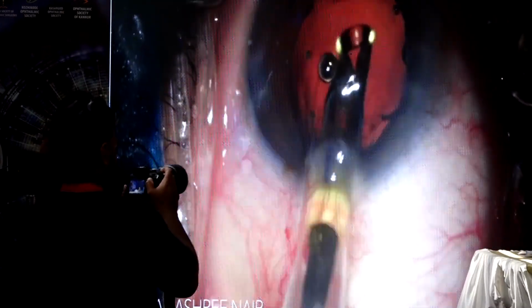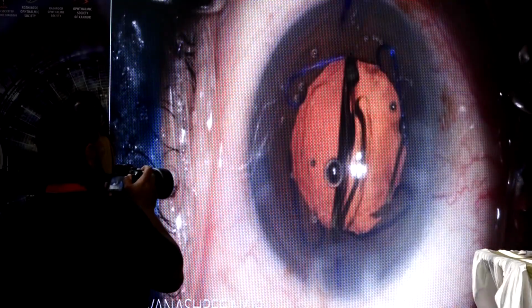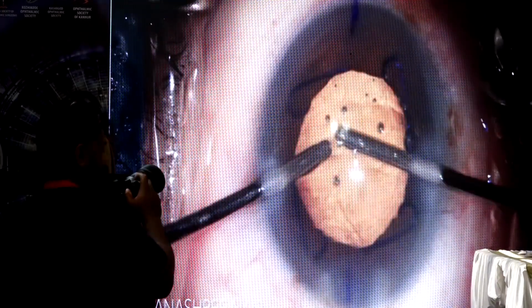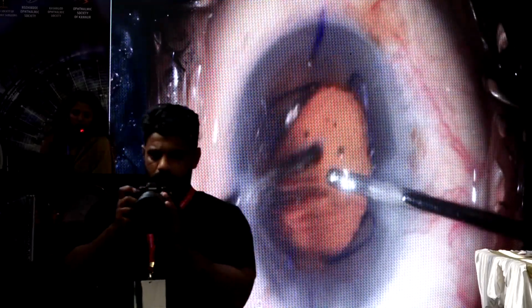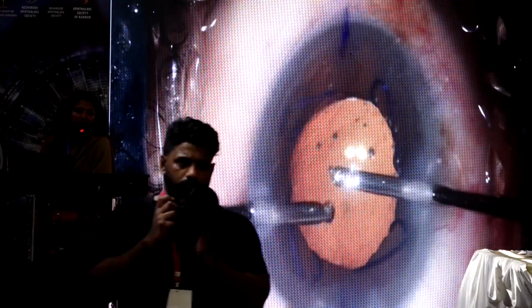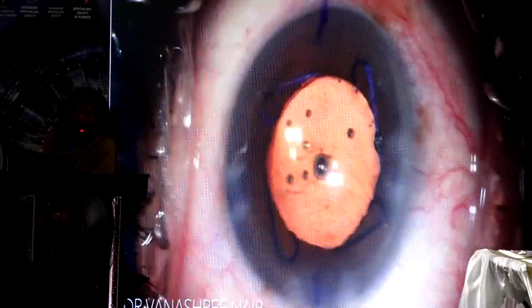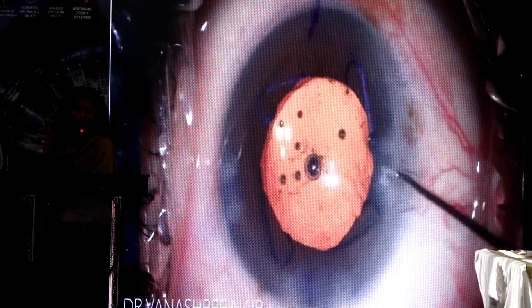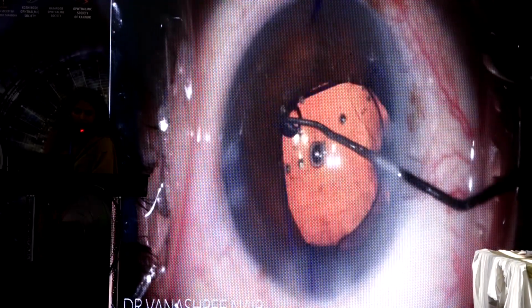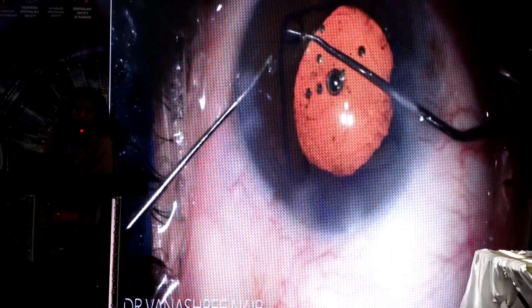Now, after the phacoemulsification, when you put the IOL, since it was a toric IOL, I wanted to place it along the axis. Remove the viscoelastic from the back, but let some viscoelastic remain in the AC, or if you feel you've washed out too much, go and inject a little bit of viscoelastic, because when you disengage the scrolls, you need the AC to be well formed so that it doesn't go and touch the endothelium.